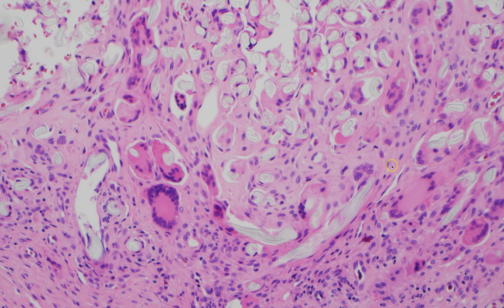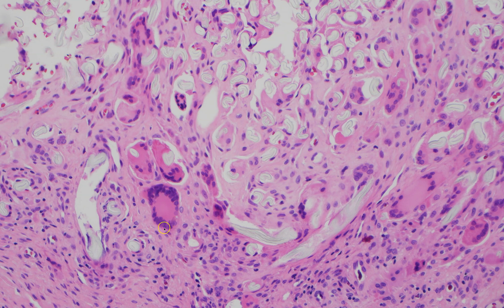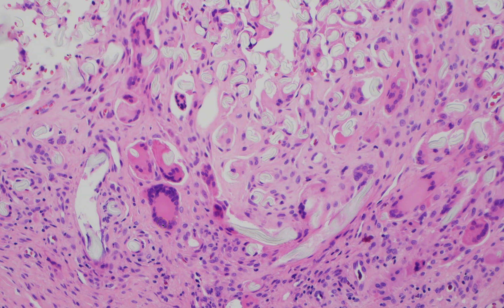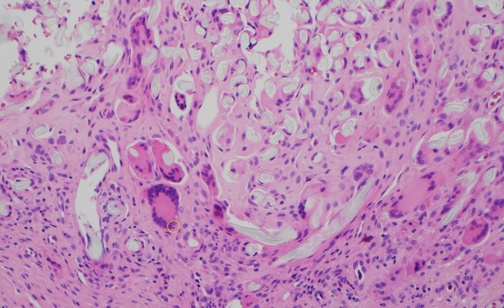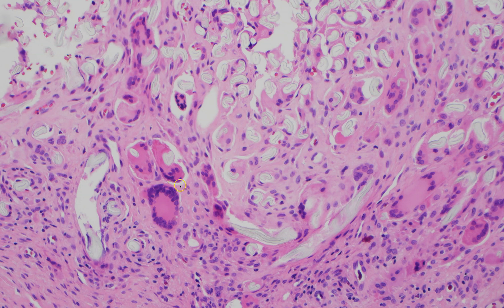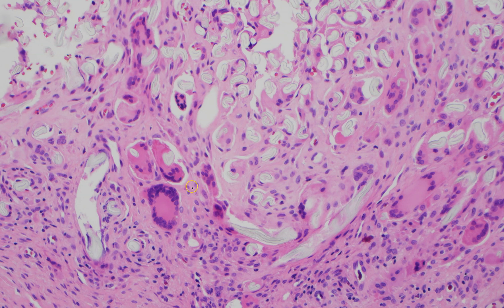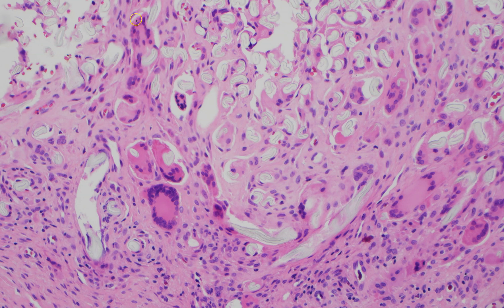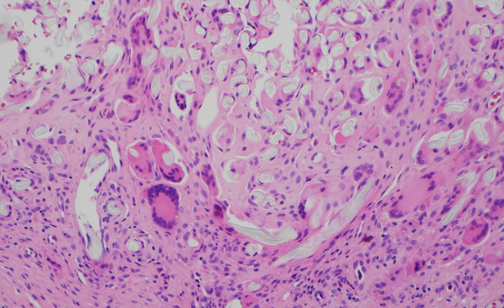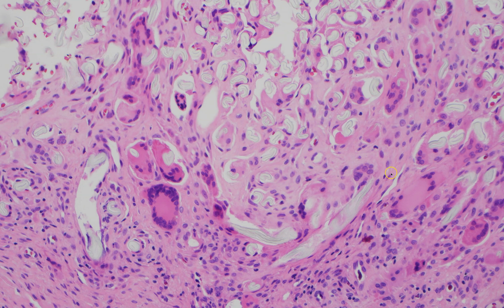Here's another closer view without the condenser flipped. You can see the really nice multinucleated giant cells. This one where the nuclei make a ring almost looks like a Touton giant cell, which is another type of giant cell seen in things like juvenile xanthogranuloma. But Touton giant cells not only have a ring of nuclei — they usually have a little outer layer of foamy vacuolated xanthomatous cytoplasm, and we don't see that here. When you see giant cells with lots of nuclei, particularly if the nuclei are all pushed over to one side and there's a piece of foreign material, that's a foreign body giant cell.